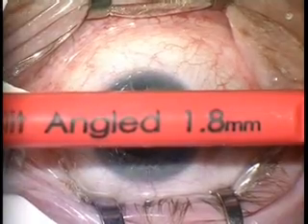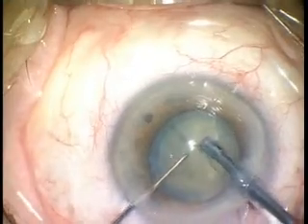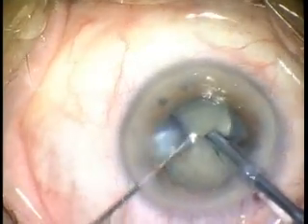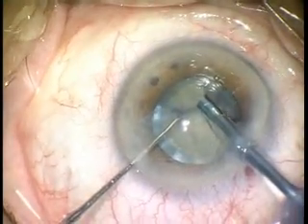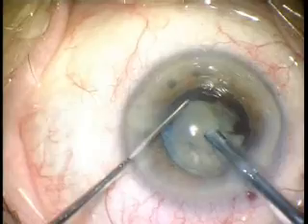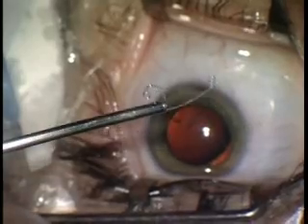In the growing field of cataract surgery, it is evident that the trend of micro-incisional procedures is escalating. Unfortunately, most capsule support devices are not designed to be implanted through a sub-2mm micro-incision. The Cionni ring can be inserted into the shooter up to the point of the fixation hook, but not further.